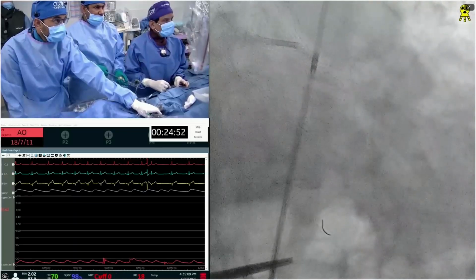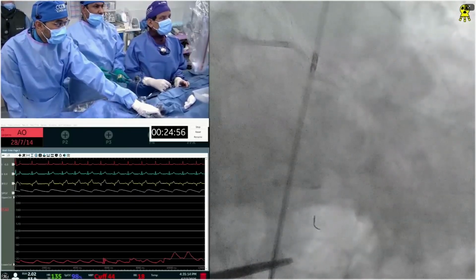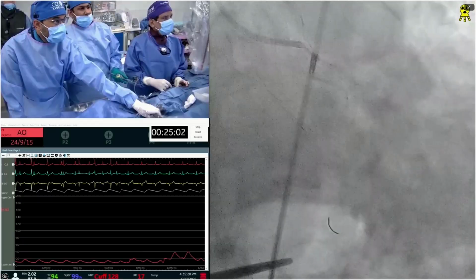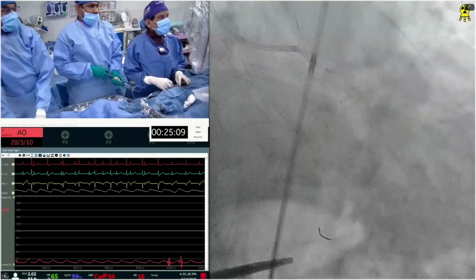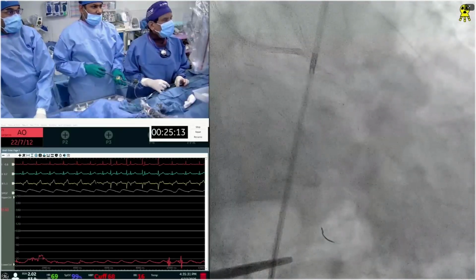What is the vessel size of the circ distal to the lesion? They say it's a big vessel. That's 3.5 to 4. Yeah, and your distal left main is on that area, a little higher maybe? Yeah, exactly. So you're planning to put a 4.0? Yeah, I think we put a 4.0, 20, but let's get a 4.0, 24 Megatron.